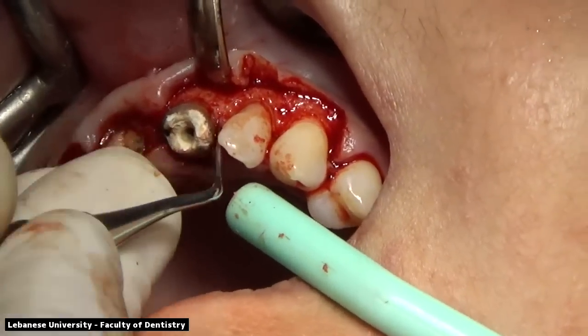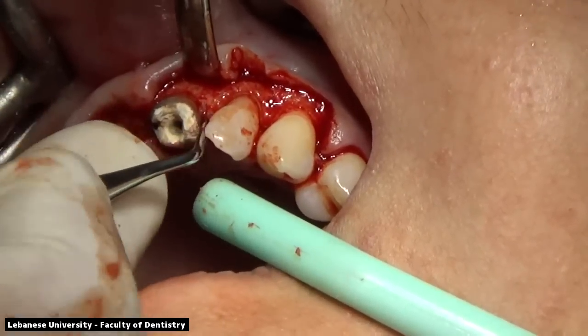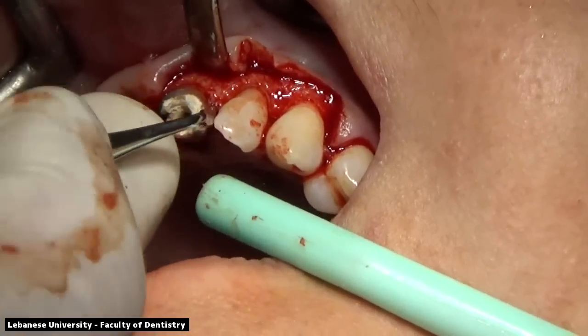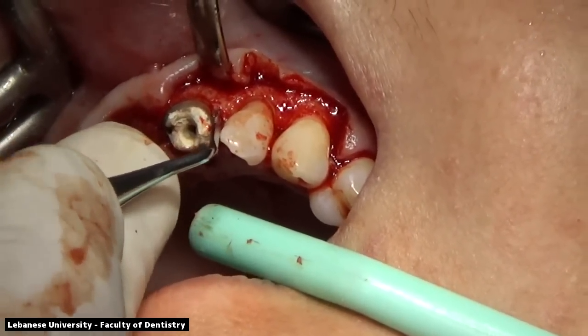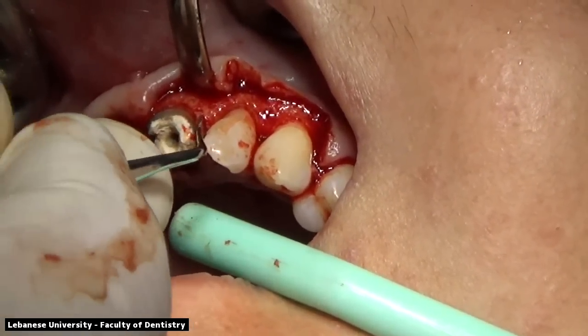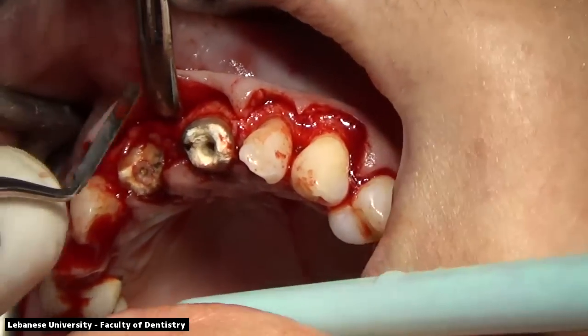Once the right central incisor started moving, we moved on to the left central incisor, and we're doing the same motion, buccolingual, starting from the distal side and then moving to the mesial side. Once we feel that the root is slightly movable, then we can proceed with our remaining root extraction forceps to remove it atraumatically.